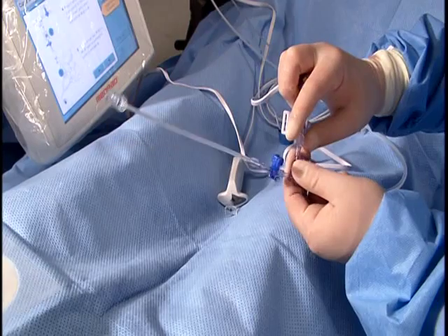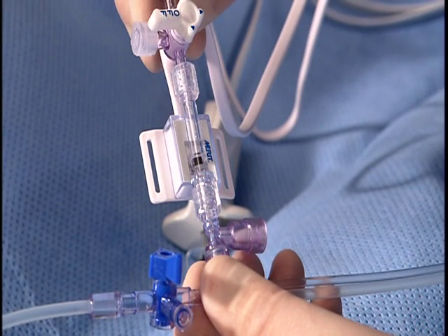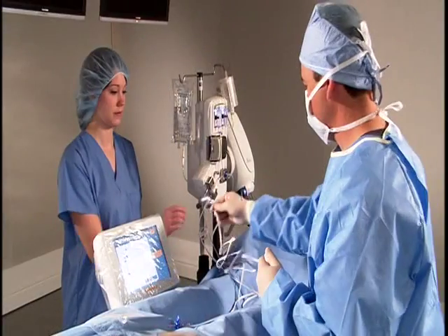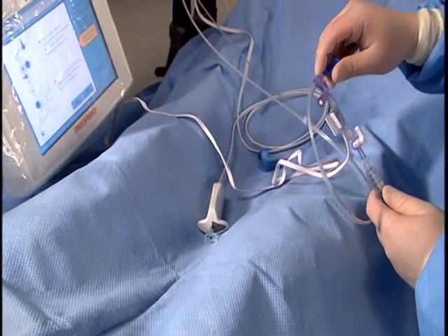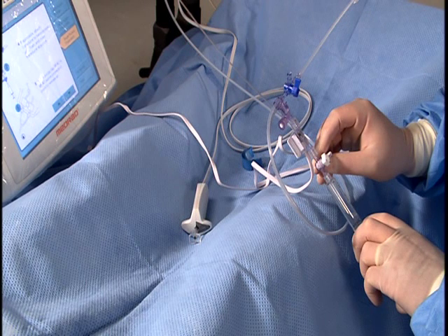With AVA500 SPAT-E and L, continue by attaching the transducer directly to the PIV hemodynamic port via the luer connector. Verify the transducer stopcock is open and the waste port stopcock is closed to the waste port. Connect the transducer cable to the hemodynamic monitor. Next, attach a 10 cc saline syringe to the transducer port. Hold the SPAT parallel to the patient with the PIV and 10 cc syringe pointing upward at a 45-degree angle.